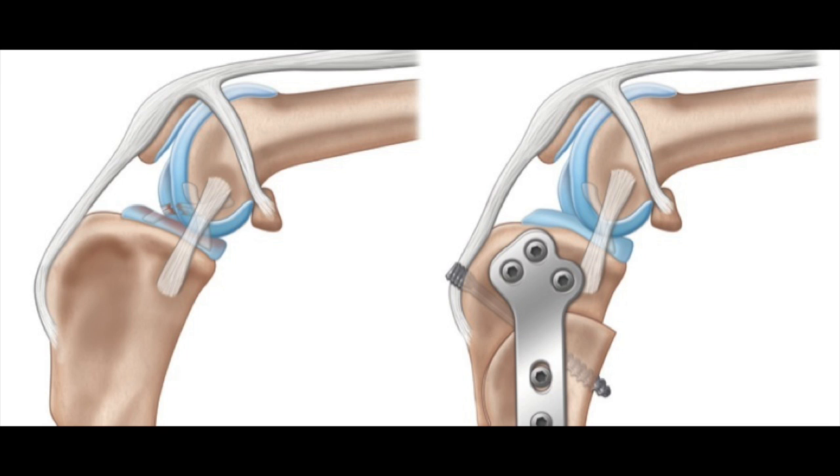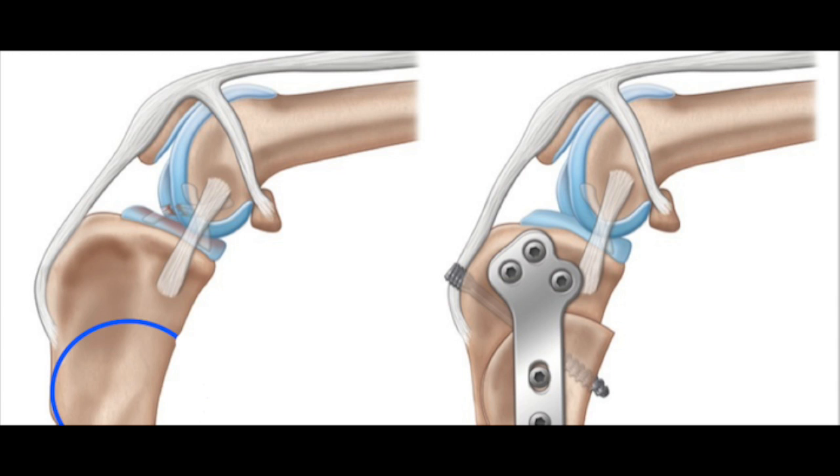This is an illustration of the lateral aspect of the canine knee joint. In the picture to the left, you will see the knee with the torn ACL. In a moment, you will see a blue line that signifies the osteotomy, or the bone cut, that is made during the CBLO surgery. Then looking at the picture to the right, you will see where the cranial portion of the tibia has been rotated forward, then stabilized with a compression screw and a permanent plate.